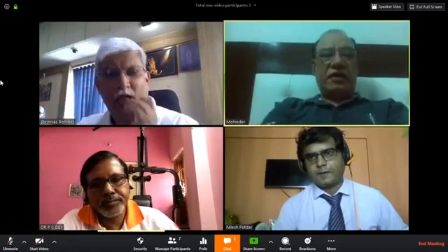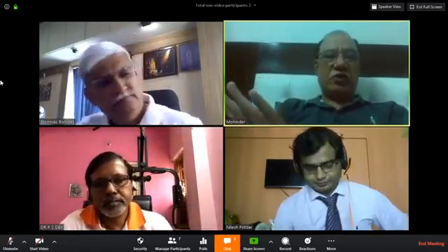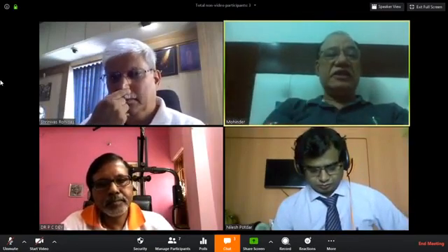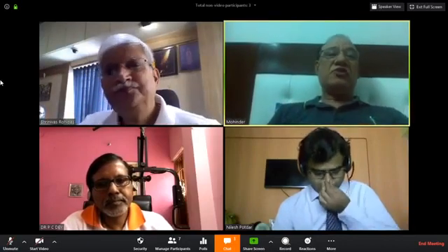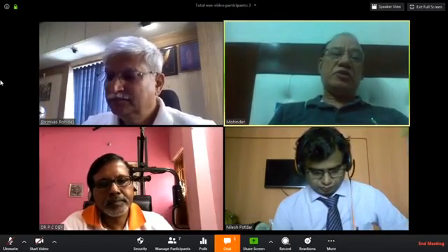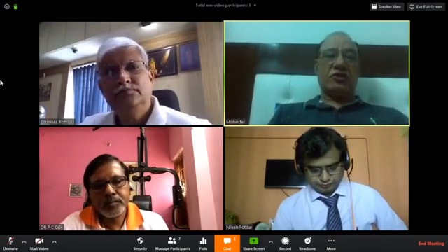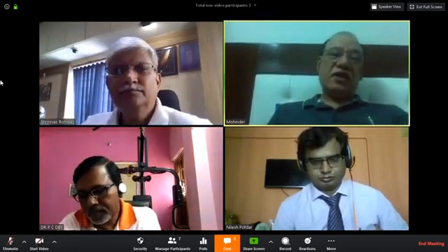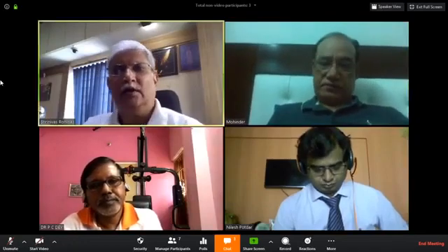I have tried knee chest position also. I have tried simple prone position without bolsters and on bolsters also. I didn't find much difference. But surely with the knee chest position, which Dr. Rohidas or PC are using, the interlaminar space opens up beautifully intraoperatively, which doesn't happen in a normal position. But my position is always prone with neutral lordosis. I never use lordosis; I always make it neutral. Whereas in the Rohidas or PC position, I think you totally reduce it and make it anti-lordotic. Okay, next.